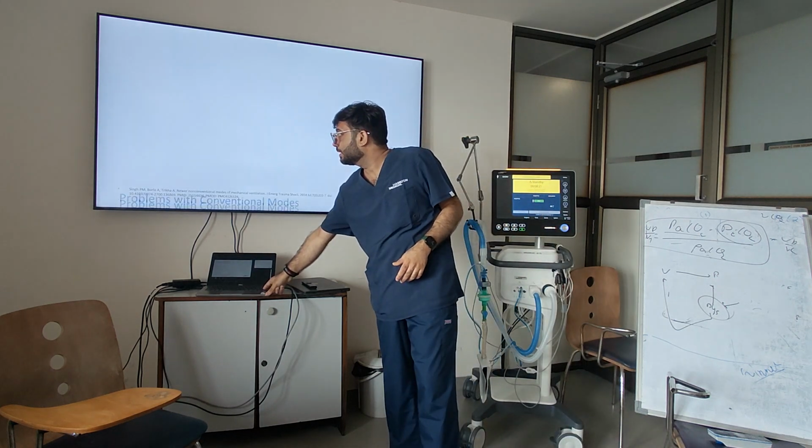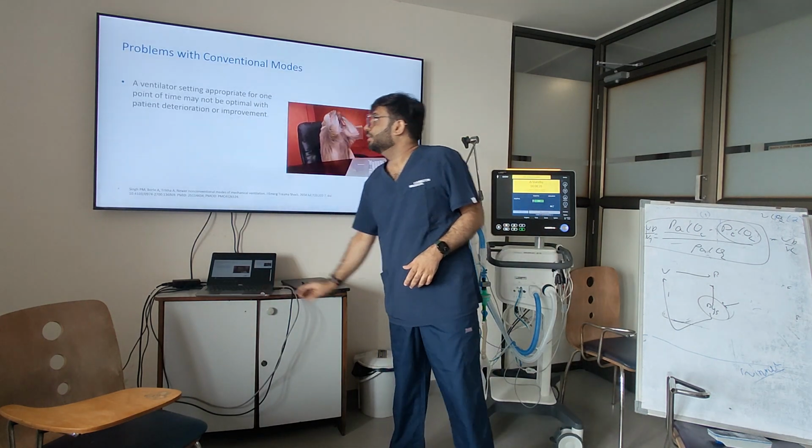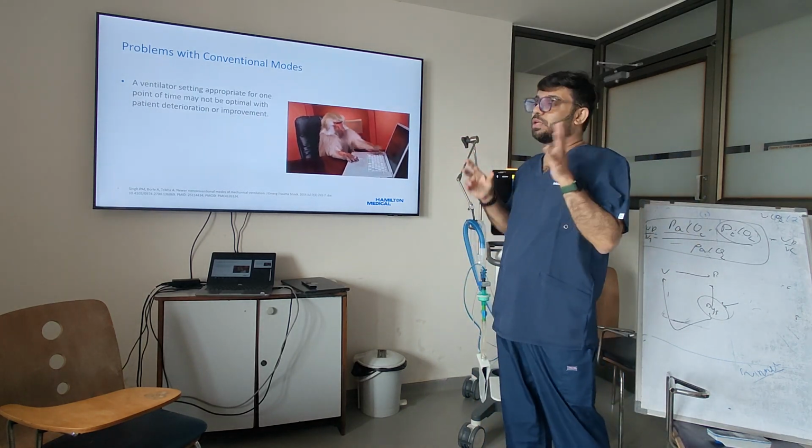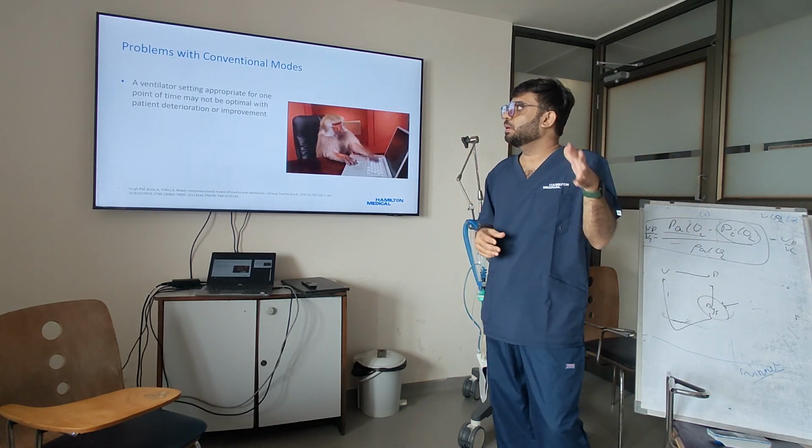Now, what are the problems with the conventional modes? The ventilator settings appropriate for one point in time may not be optimal as the patient's condition changes.